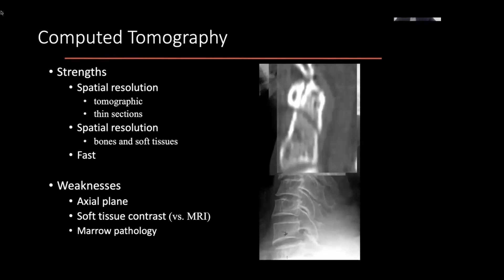Spatial resolution is a term we use in radiology to say that you're able to depict very small structures. And you're able to see bone particularly well — particularly cortical bone. Soft tissue, not as well, but certainly better than you would see on a plane film.